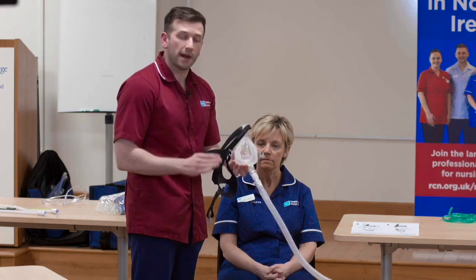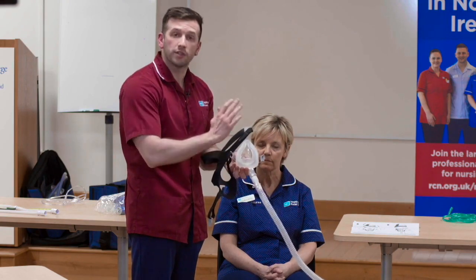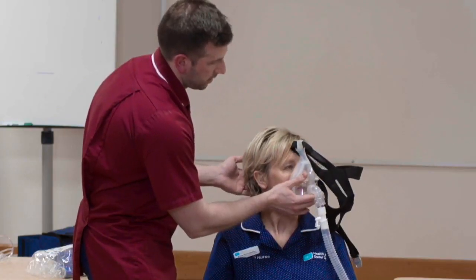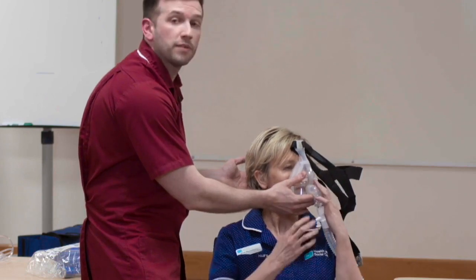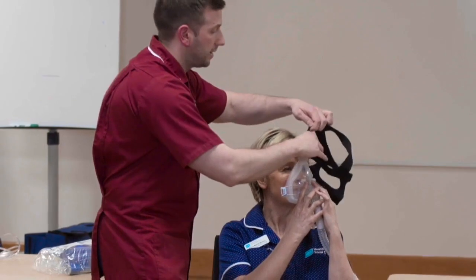In application of the mask, I will first apply the lower section of the mask and roll it onto Anne-Marie's face, as demonstrated now. At this point, if the patient can hold the mask in place, or another member of staff can help you. Next, I will apply the headgear.